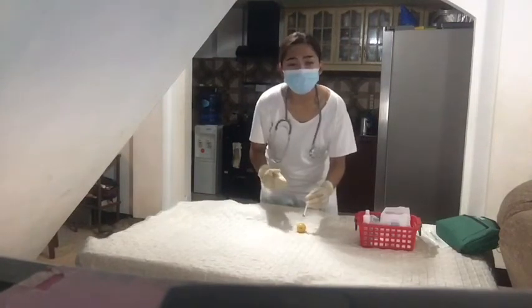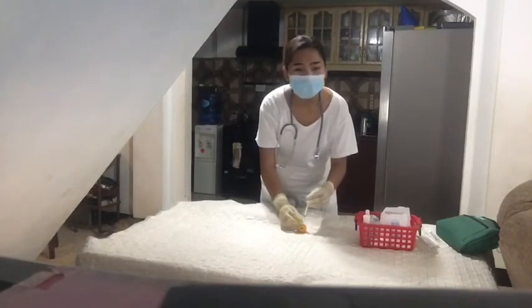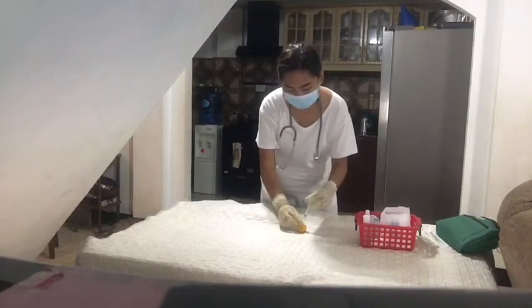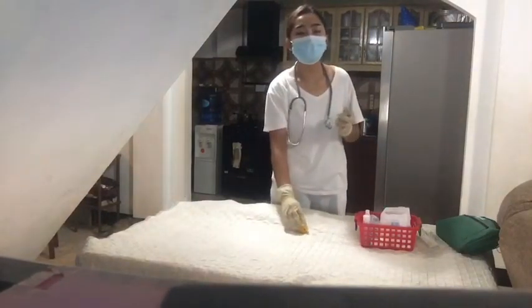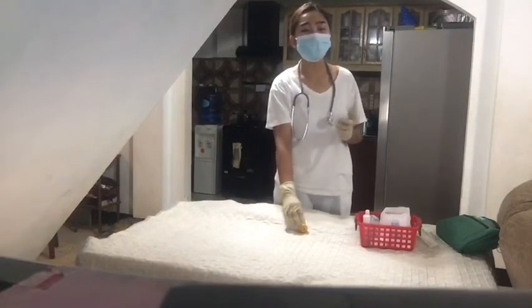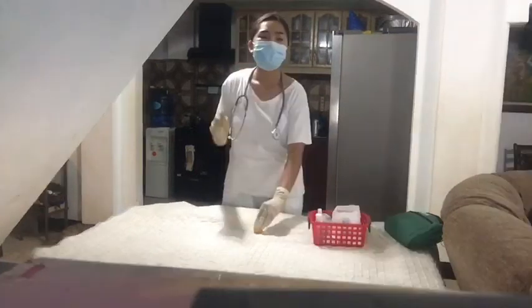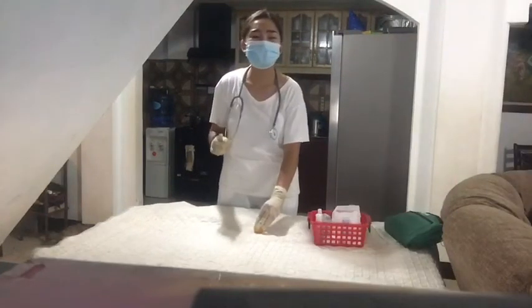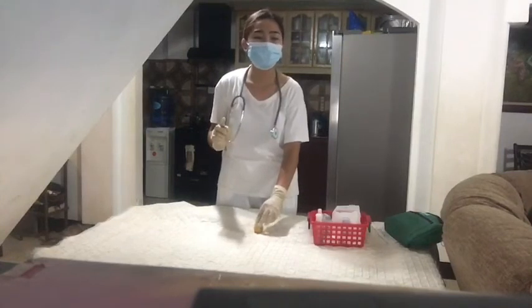After that, quickly withdraw the needle while applying pressure with a dry sponge. Because slow needle withdrawal may be uncomfortable for the client, so we have to do it quickly. And after, we will now assist the client to a comfortable position. This is to provide patients comfort.